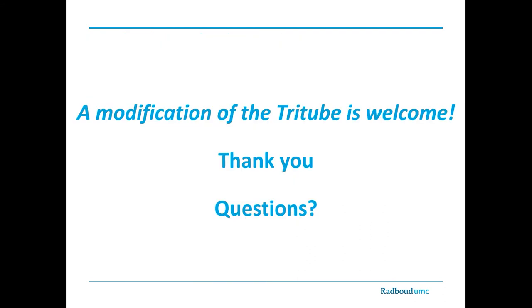So a modification of the Tritube to better fit the distal trachea or the left or right main bronchus would be very helpful for our practice. So we can also perform more distal surgery with the use of Tritube. Thank you all for your attention. We would like to see if there are some questions we can answer.